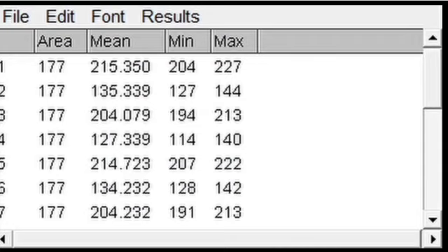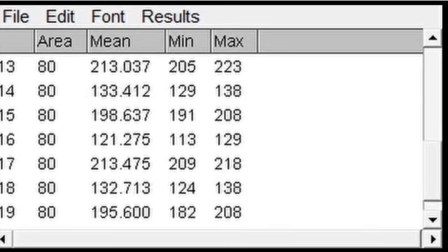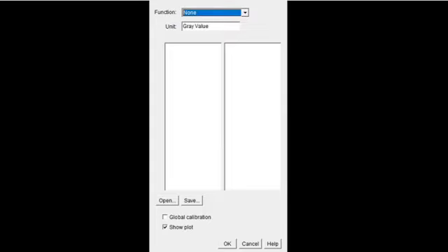And then from there, you want to click on the calibrate function within ImageJ, and then you give the average values, the average grey values. So in this case, it's roughly 130 for the dentine and 210 for the enamel. And then you use the straight line function, and the unit is grams per cubic centimeter.